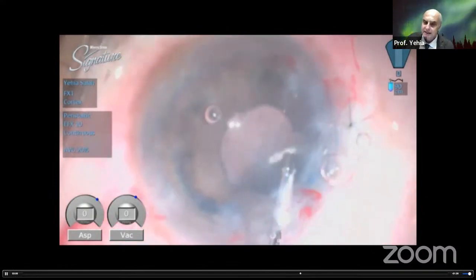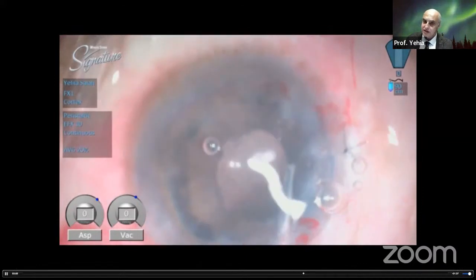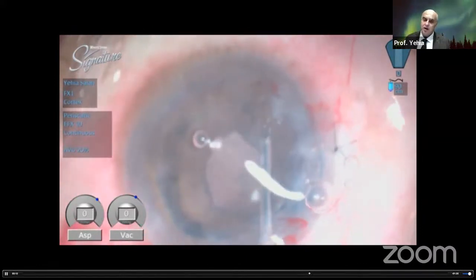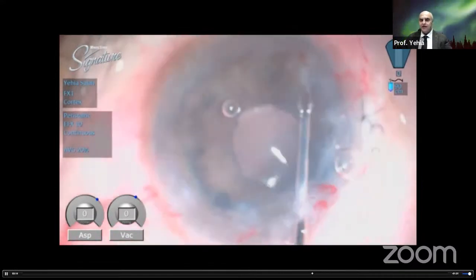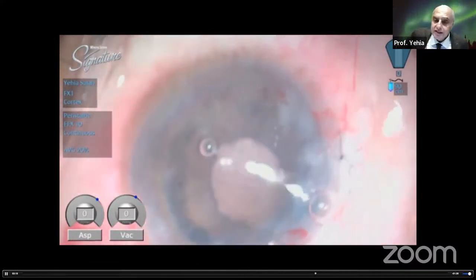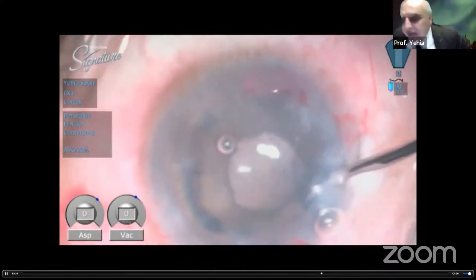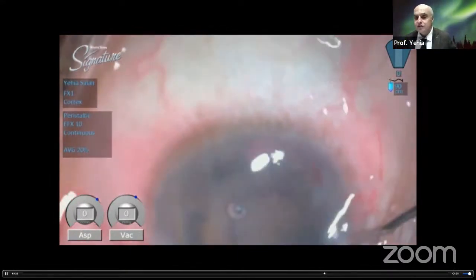One of the things that can be used is this stretching. And you might do a pupilloplasty. Amar Agarwal, as you know, has published a paper in angle closure glaucoma of using the pinpoint pupil. Here, I'm not doing this. I'm just stretching the iris away after doing the viscodissection.